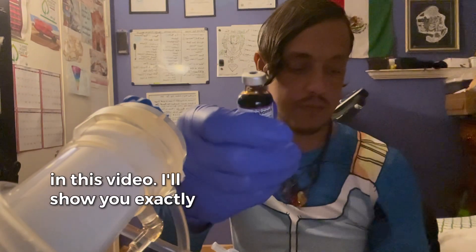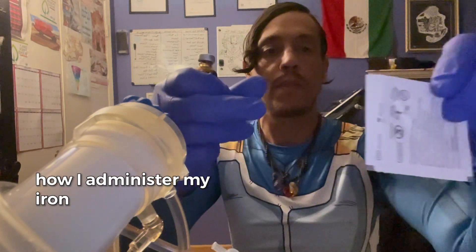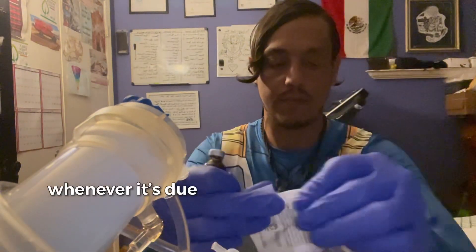In this video, I'll show you exactly how I administer my iron whenever it's due.